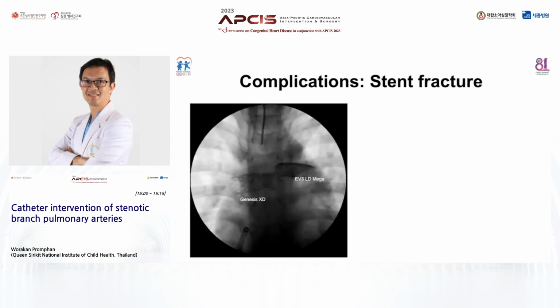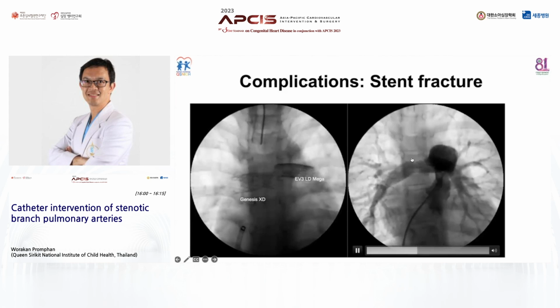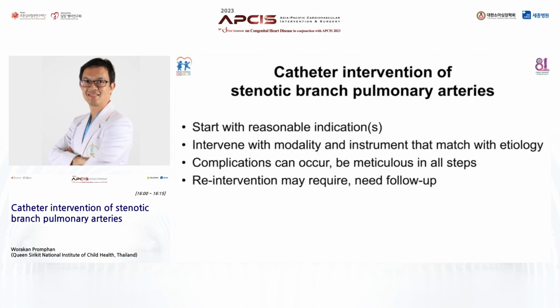So here's one complication, a stent fracture. As you can see here, we implanted 2 stents, Genesis XD and EV3 LD Mega. And somehow, a few years back, the Genesis was fractured. So with that, we had to reinforce that area by putting in another stent, which is an EV3. So with that, we can eventually treat the patient quite well.